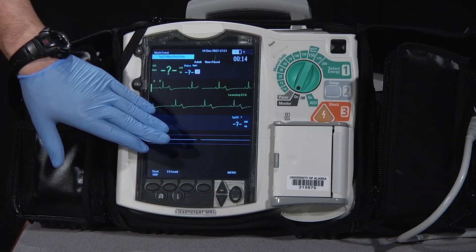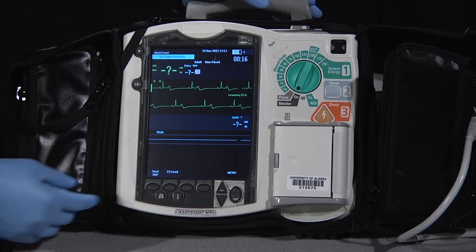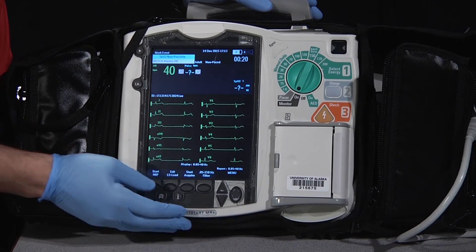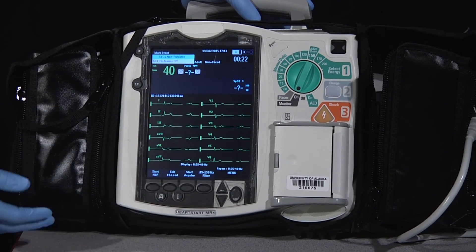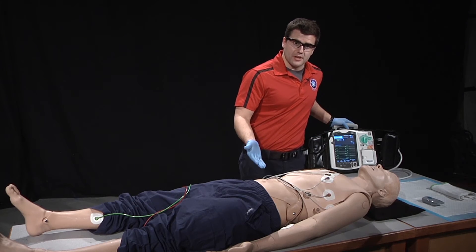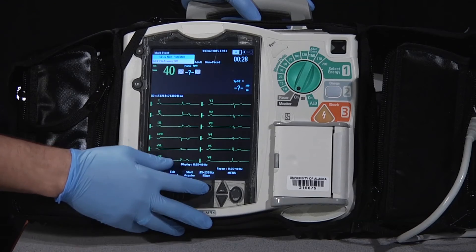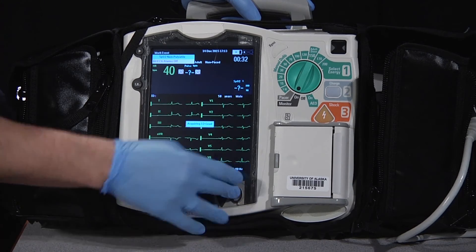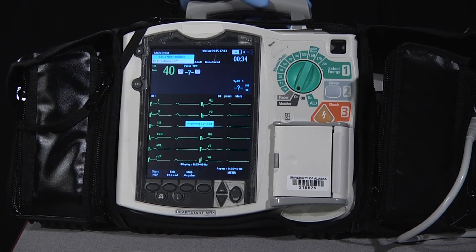We also want to make sure that we're not receiving any error messages. From there, we're going to go to our 12-lead section of our monitor. We're going to let our patient know that we're about to take the picture and make sure that they're remaining still. We're going to acquire our 12-lead and wait while the machine analyzes.